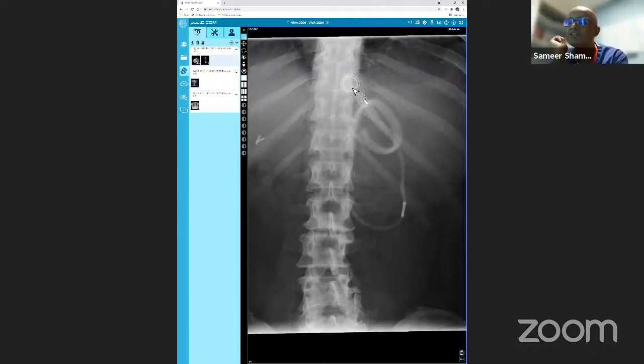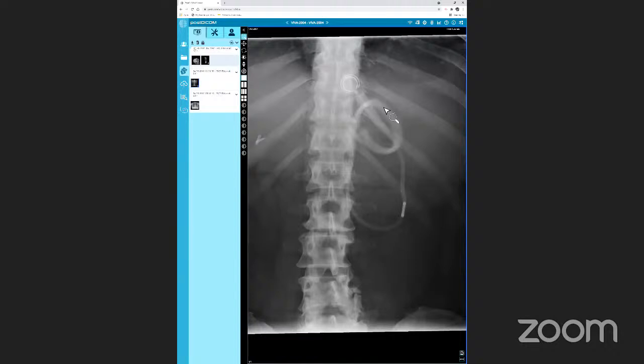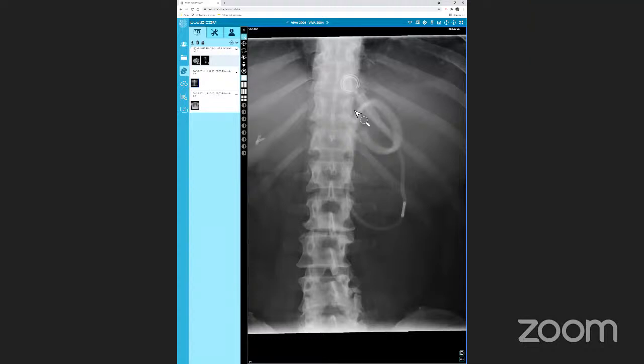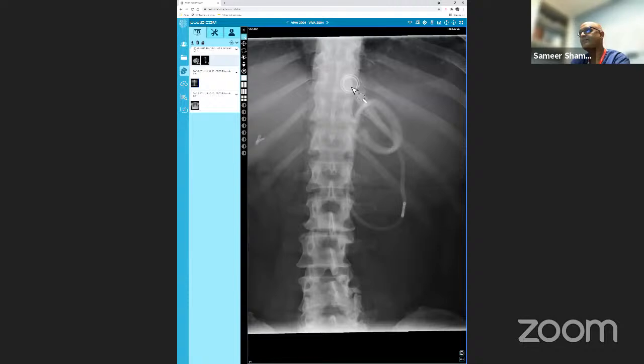If I said the patient was very fat and she wanted to lose weight and they did some surgery, this here looks like a gastric band, and this tube I'm not too sure about. So they were trying to do a gastric band surgery, and now the patient has presented with a lot of vomiting. So is this gastric band in situ, or is it in the right position?